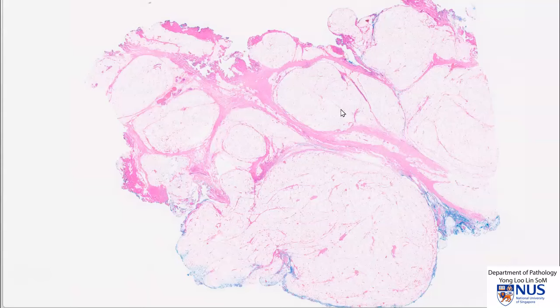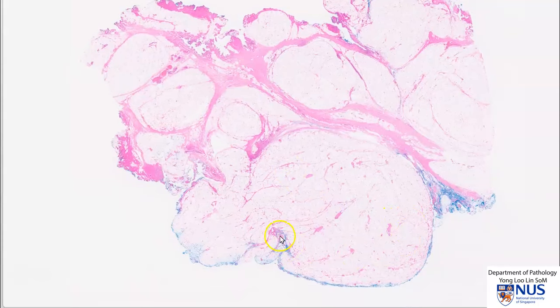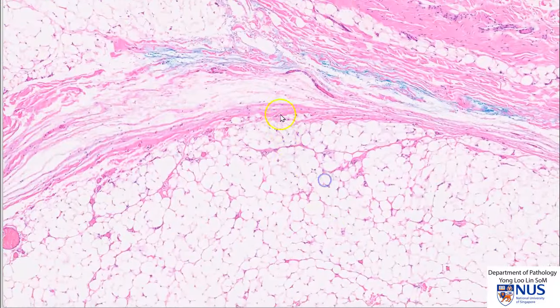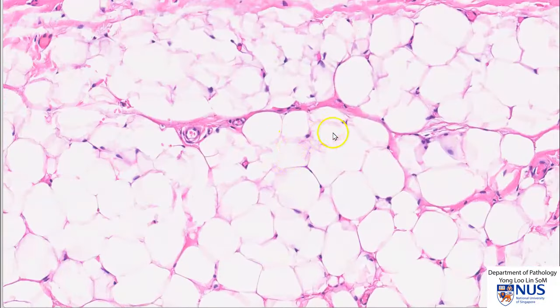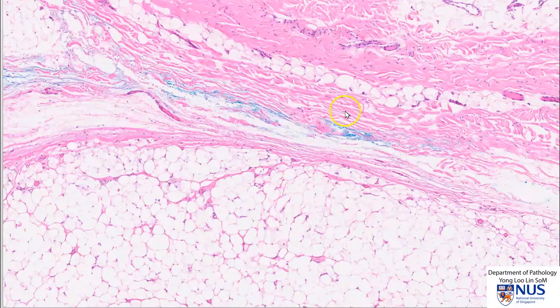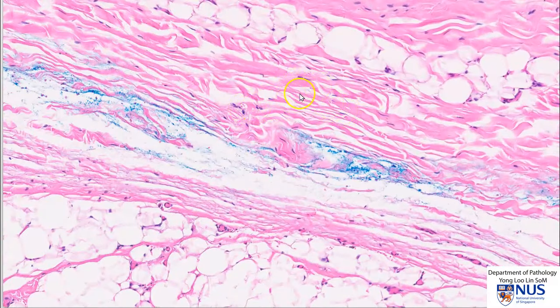Moving back to the original lipoma, in summary, this is a benign adipocytic tumor which is well circumscribed, lobulated, and composed of lobules of mature adipocytes without significant nuclear atypia and with hypocellular fibrous septae in between, again without significant cytologic atypia. Thank you.